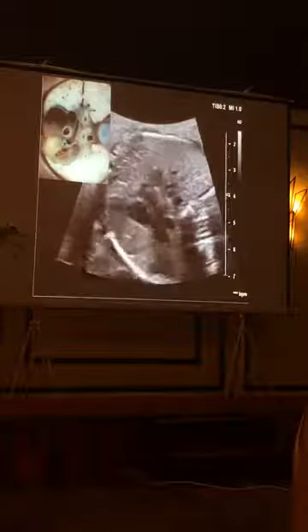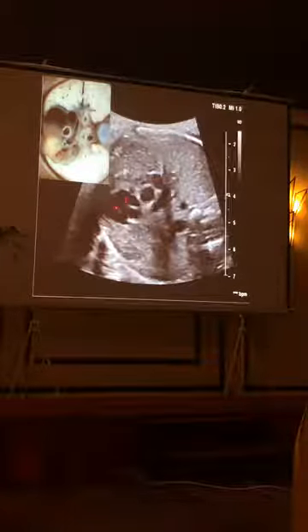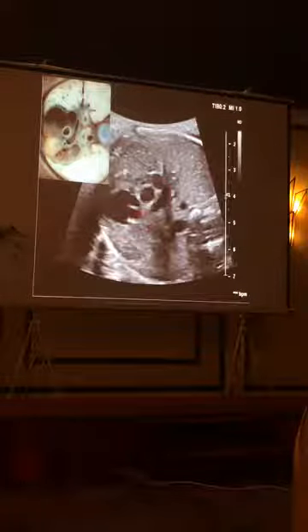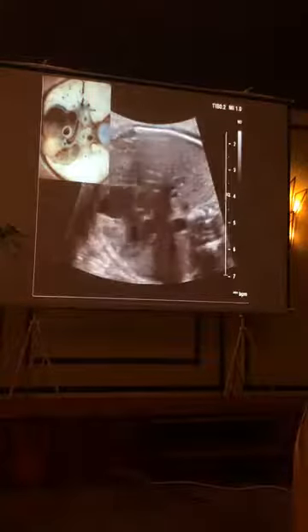And now we are moving down and more horizontally, and you can see this kind of view where the pulmonary trunk branches, and you can see the branches of the pulmonary trunk with the right pulmonary artery behind the aorta and the SVC.